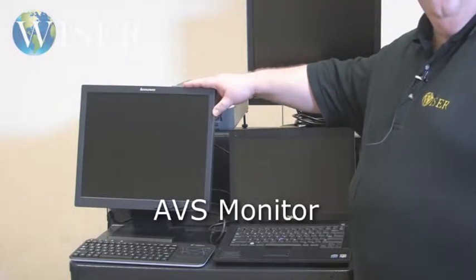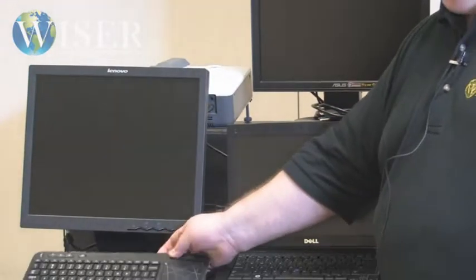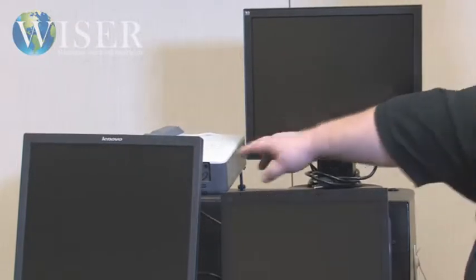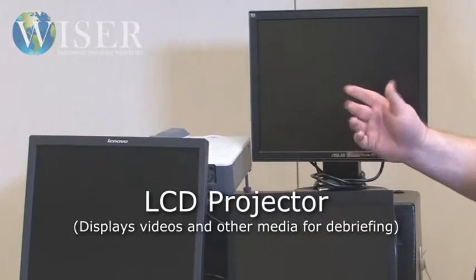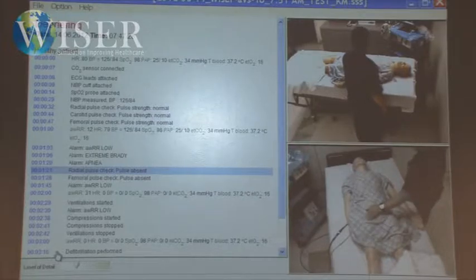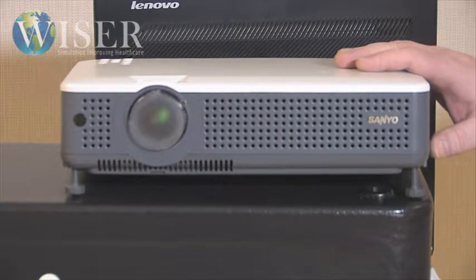This is the monitor for the AVS system, and this is the keyboard and mouse for the AVS system — a Logitech keyboard-mouse combination. It's wireless; we chose it mostly because it's small, but it's been very effective. This monitor is the patient monitor, and we have a projector here that we can use for displaying debriefs. It shows the same image you would see on the AVS monitor, and we use it for debriefing so you can debrief wherever your class happens to be — a hallway, a room — as long as you have a flat surface to project on.